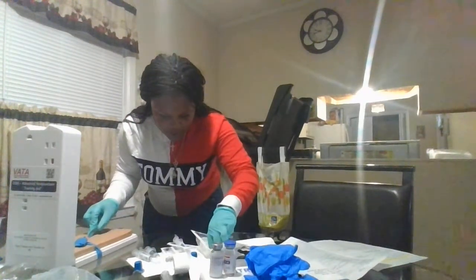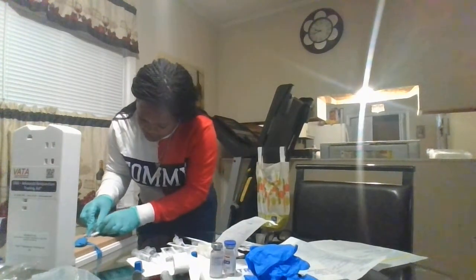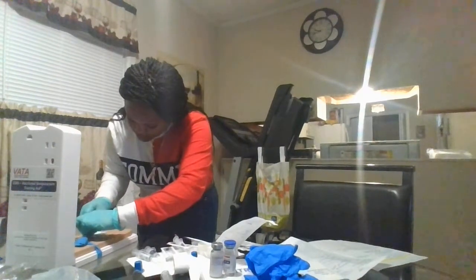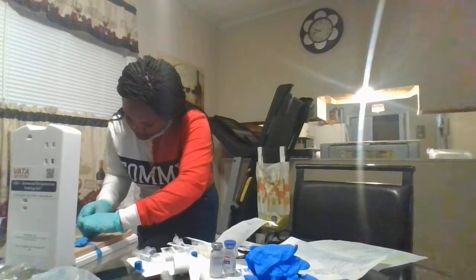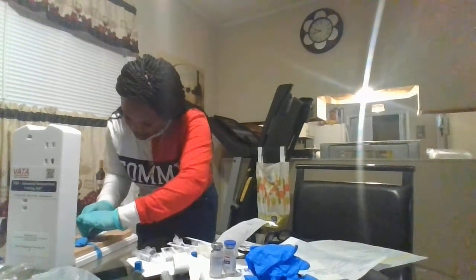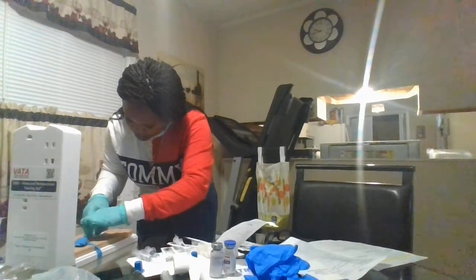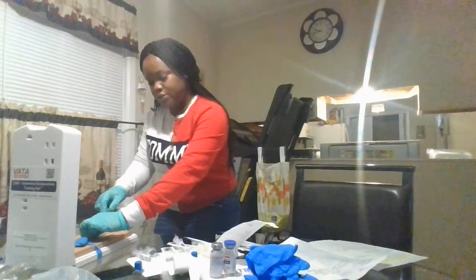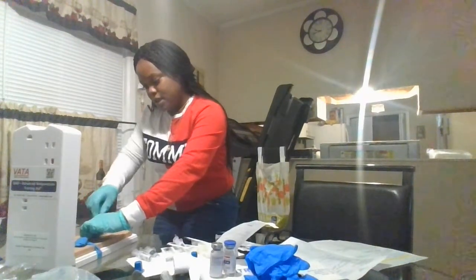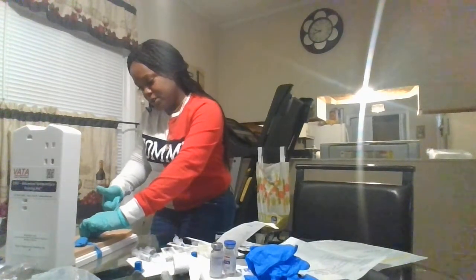I'm going to get my gauze and place it underneath there to catch any blood. Now, if I had my extension, I would insert my extension, making sure that I'm securing the catheter that's inside of the vein. I will now insert my extension, aspirate, flush.